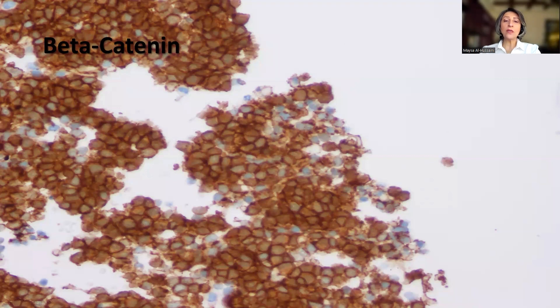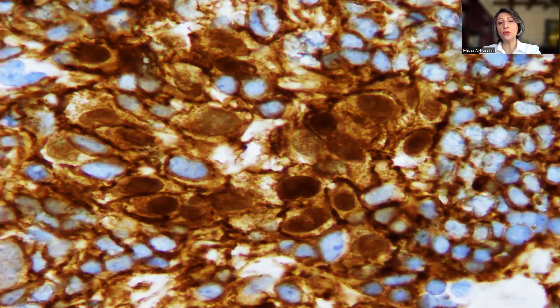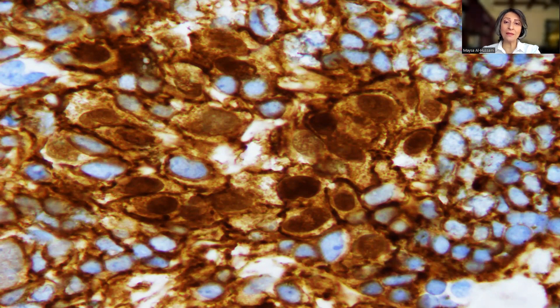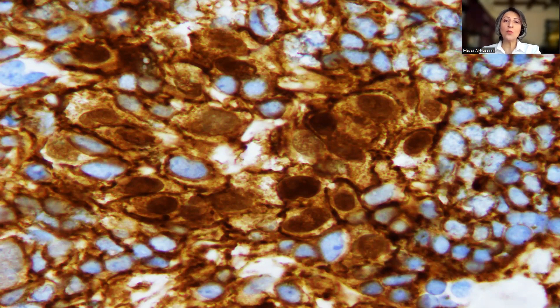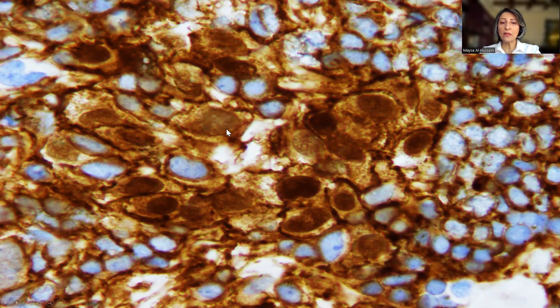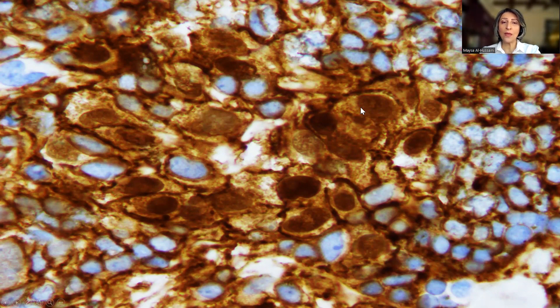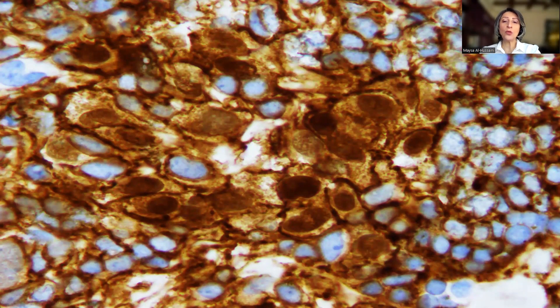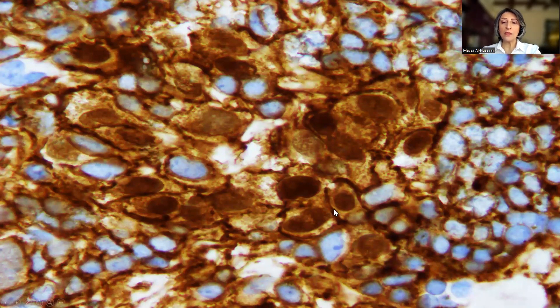What I did afterwards is that I put an oil immersion and took those images on the highest power — on the oil lens, which is 100x. And as you can see beautifully here, these are the non-mutant nuclei, and these are the mutant nuclei. I was really happy that this would help to sort out how to interpret beta-catenin in various tumors, but in particular in medulloblastoma.